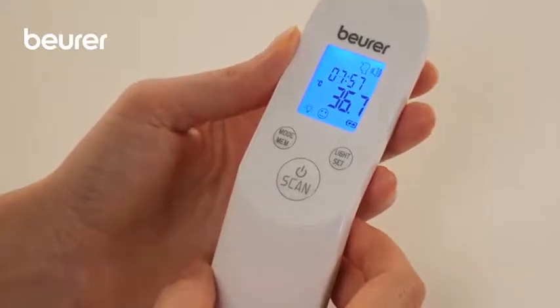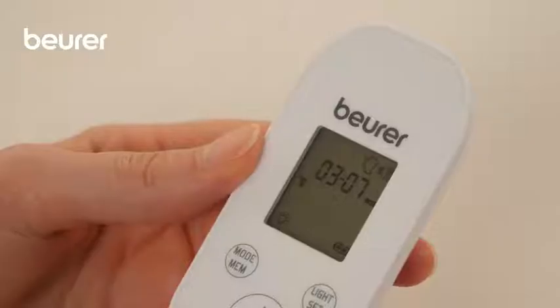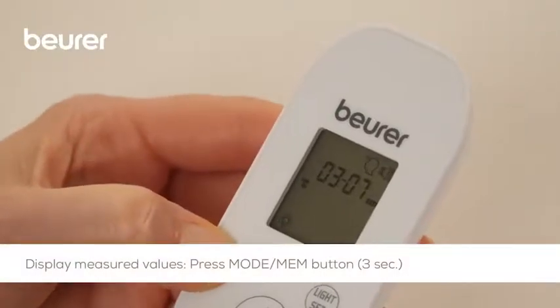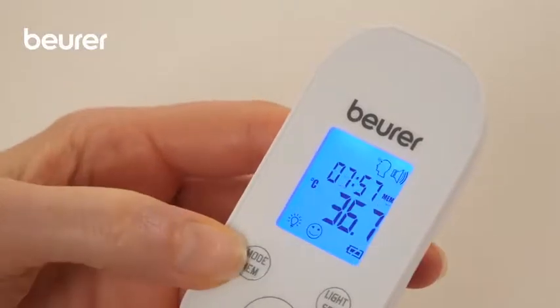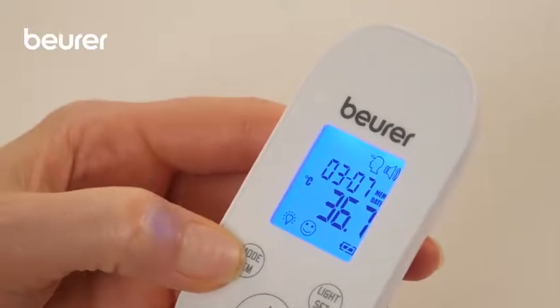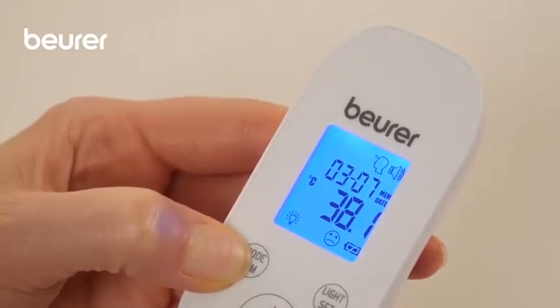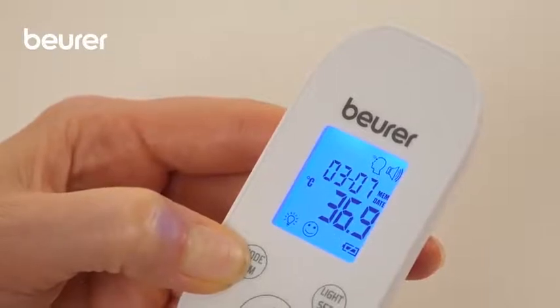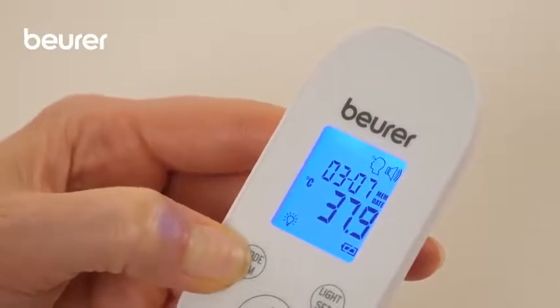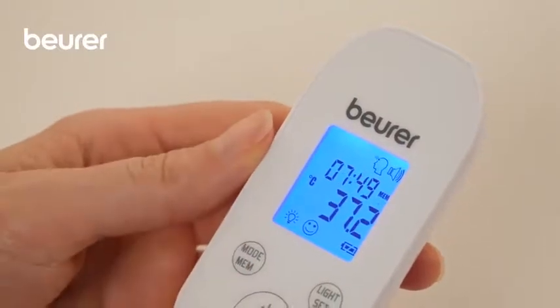The device is ready to take another measurement when two short beeps sound and the forehead symbol stops flashing. The device only stores measurements in forehead temperature mode and only values from the last 60 measurements. When 60 memory spaces are exceeded, the oldest value is deleted. The memory can be recalled by pressing the mode MEM button for 3 seconds while the thermometer is on. The most recent measurement is displayed, and pressing the mode MEM button again will display the next measured value.